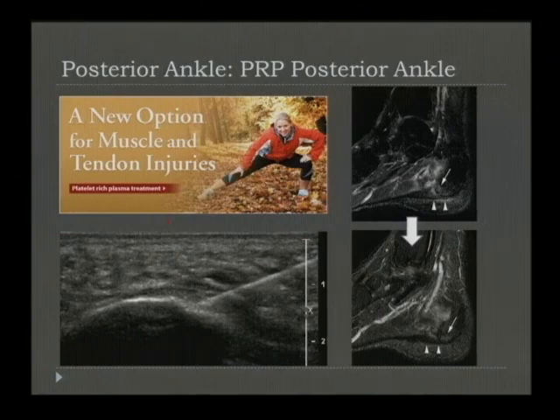More recently, we've been getting patients who have been refractory to all therapies, and so we have been performing platelet-rich plasma treatments to this area. We take the patient's whole blood, spin it down in a centrifuge, and then place our needle in the area of fasciitis and inject a small aliquot of this platelet-rich plasma, usually approximately 3 cc's. We also fenestrate the fascia as well. They will not get immediate pain relief. It usually takes months for them to feel the effects of PRP.